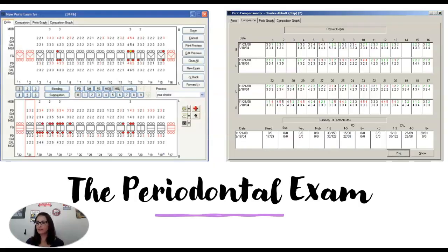They're going to be looking at the pocket depth using a special instrument that is going to be going into that gingival sulcus along that free or marginal gingival area, and determining what those numbers are, how much bone loss, if any, there is. A 1 to a 3 is considered to be normal. Anything over a 3 is considered to be bone loss. And the higher the number, that's obviously going to indicate that there's more bone loss.